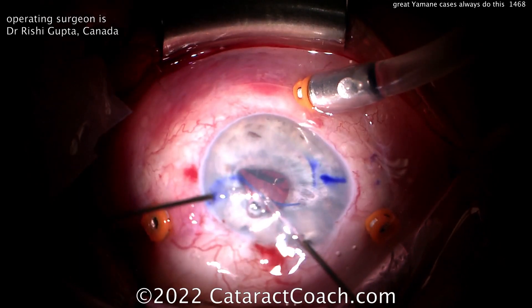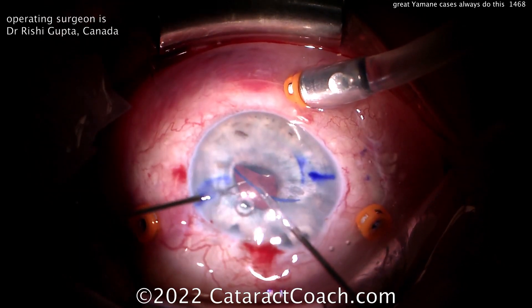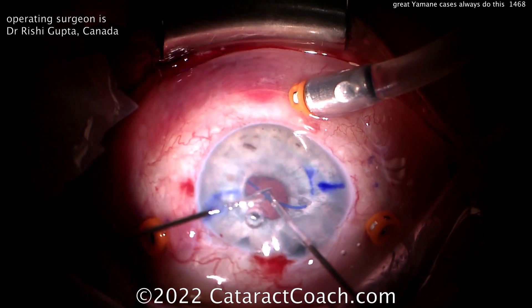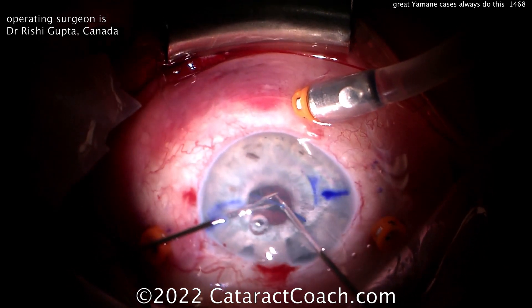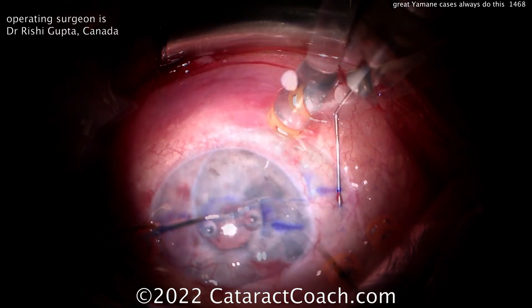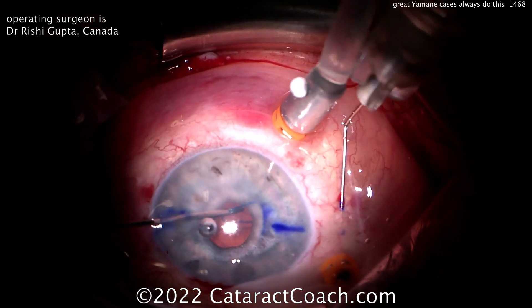Where's the optic now? Where's that leading haptic? Way in the mid-vitreous — it is deep. Where's the leading haptic? Think about it. Where's the optic? Way in the mid-vitreous. That lens is going halfway back at a minimum.